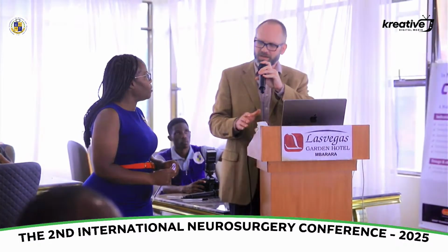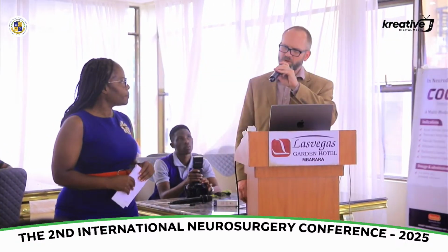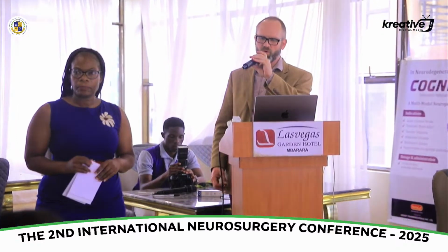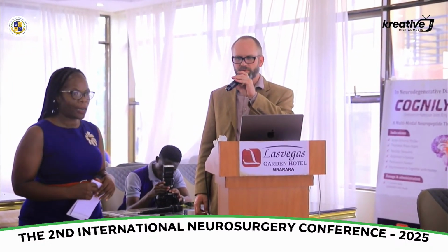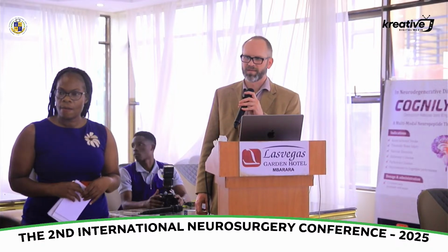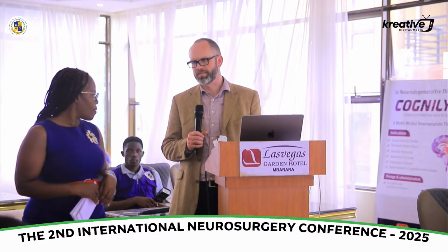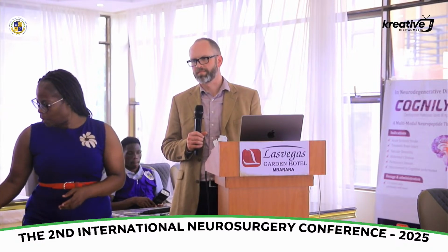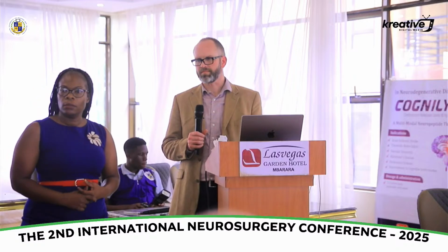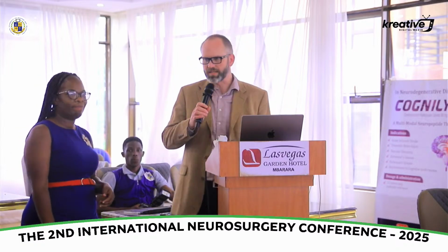Sorry, I missed the question. Oh, no, color of the skin does not matter. Hair can sometimes be a problem, so if you're trying to ultrasound through hair, you do need a little more gel so that you don't have pockets of air between them. Certainly, we haven't found that to be the case with ultrasound, no.